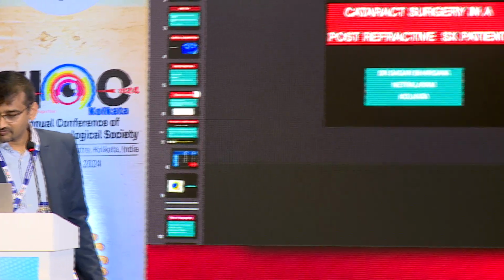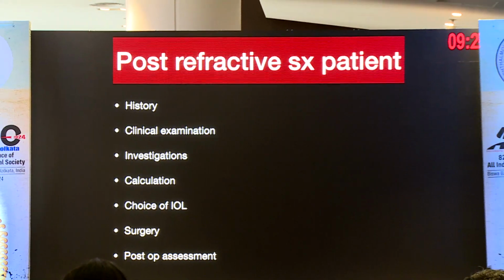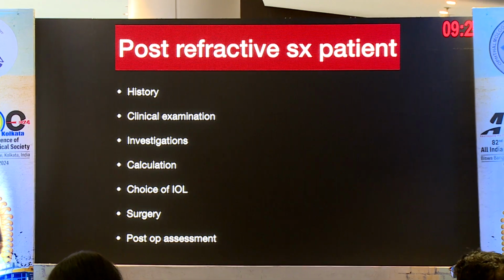So I will be speaking on cataract in post-refractive surgery patients. As we all know, a post-refractive surgery patient coming for cataract is always a challenge in terms of how to do an IOL calculation for the patient, what type of lens to implant, and sometimes difficult scenarios during the surgery. So we'll cover these aspects during my talk in brief.